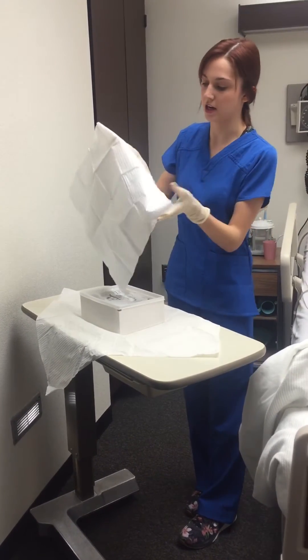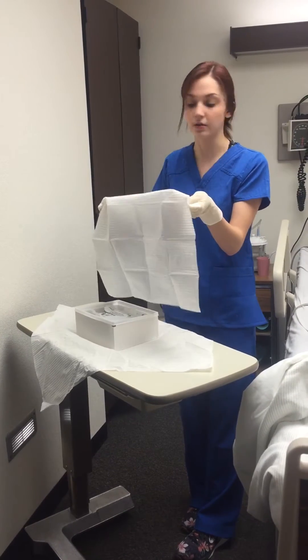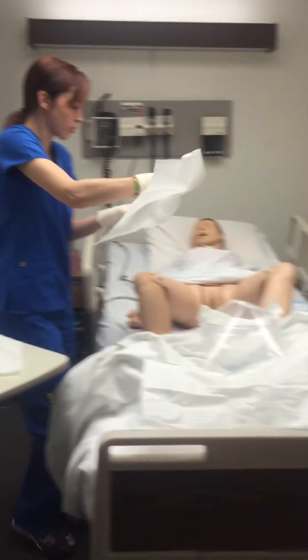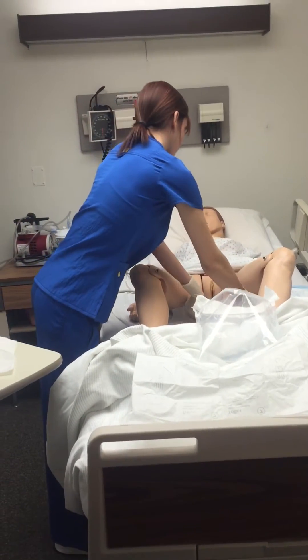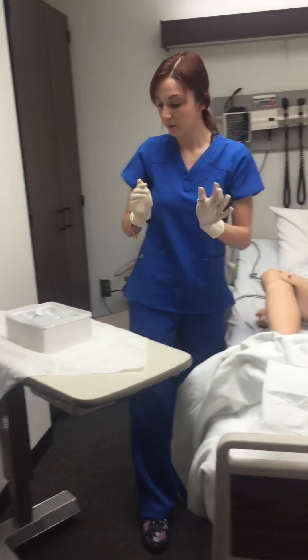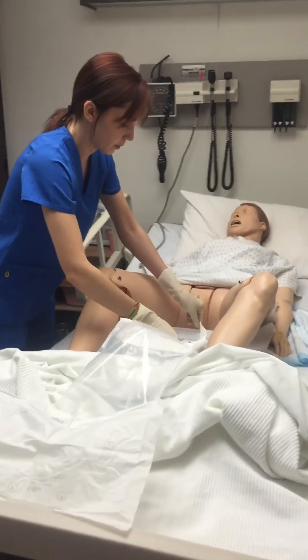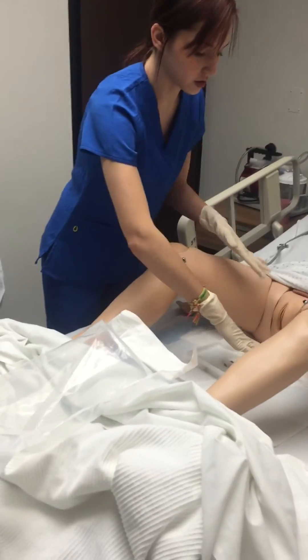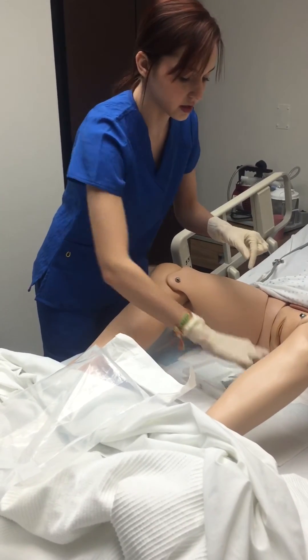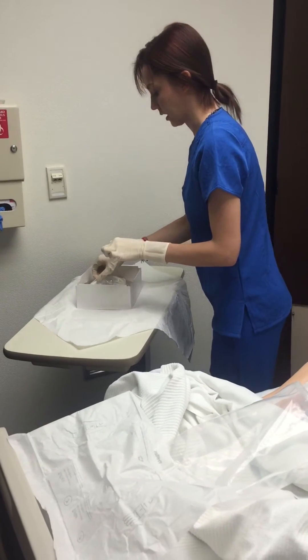I would check which side is shiny, and I would also make sure there's a chuck under her, which there is already. I would make sure my lubrication is squeezed out, and I would open the sanitary wipes packet and get my syringe ready, and I will get the catheter.